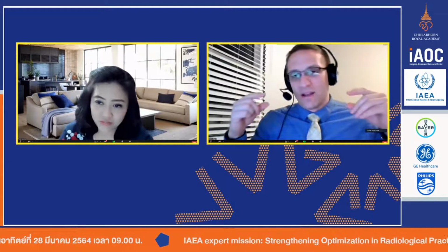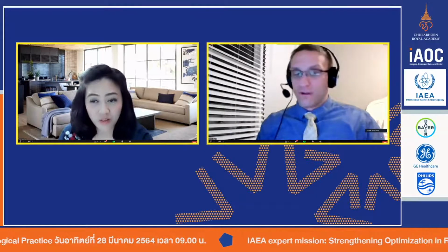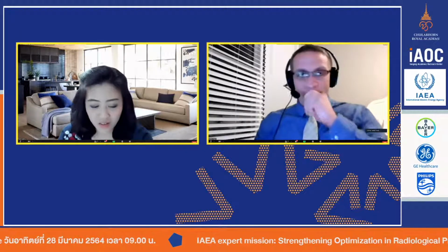But in these newer CT scanners, the detectors are fast enough that we can actually count how many photons we collect in every detector element. That's called photon counting CT. Photon counting CT is kind of the next future of where CT will be. Probably not for another 10 or more years.